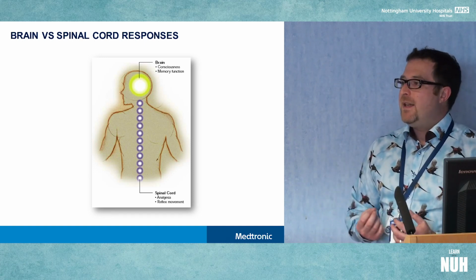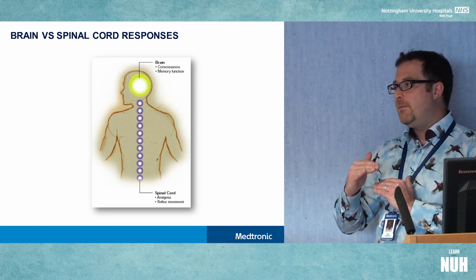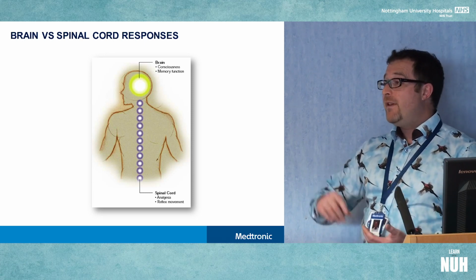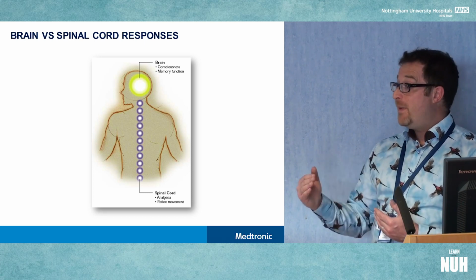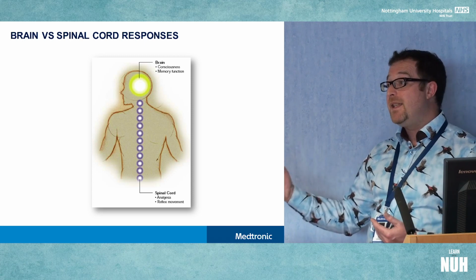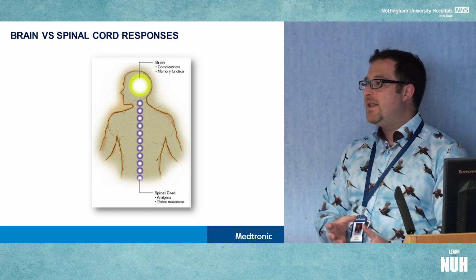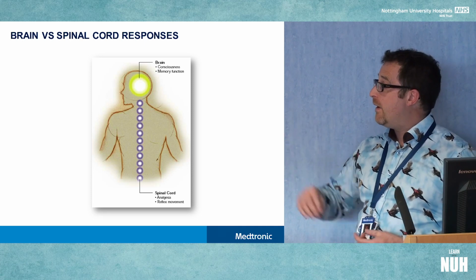What you may find is that if you're running the BIS quite deep for any given surgical stimulus or level of analgesia, you may find a certain level of volatility in BIS. If the patient's slightly lighter, or if there's a surgical stimulus and the BIS is higher, you'll get more volatility in the BIS just because that patient's less deeply anaesthetized and may need more analgesia. So you'll see that volatility.